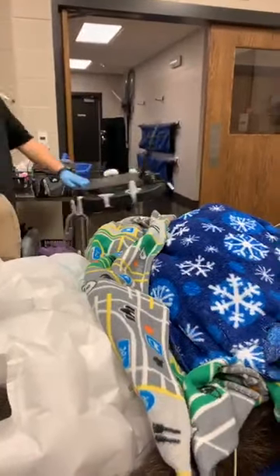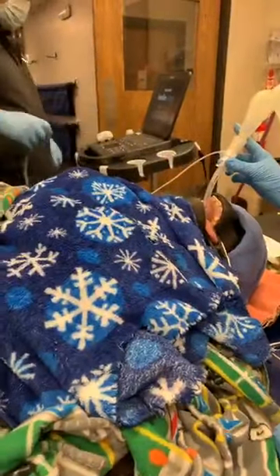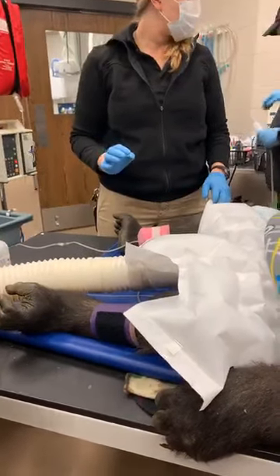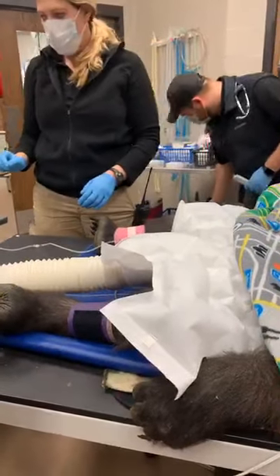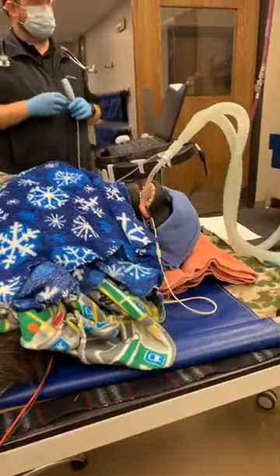Noah asked, do you maintain gas anesthesia on isoflurane? He's on sevoflurane. It's a very similar thing. It's just a little bit of a different MAC volume. So it's just our traveling machine with sevoflurane, so that's why he's on the sevoflurane. Typically, older animals or animals that are at higher risk will be on sevoflurane. It was just a convenience for him today, but they both work the same.